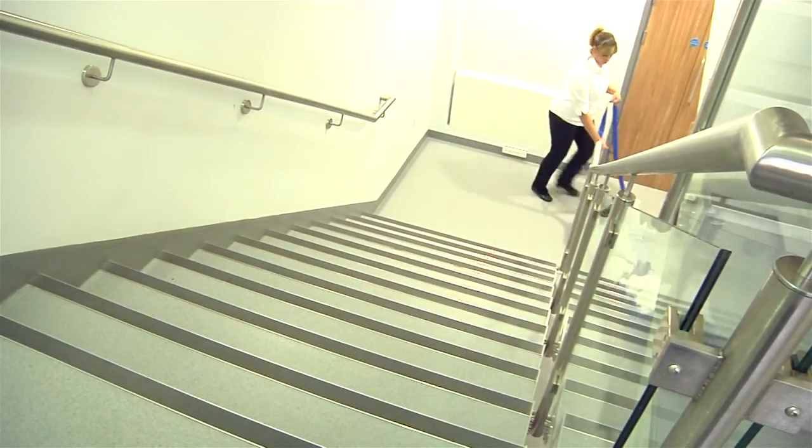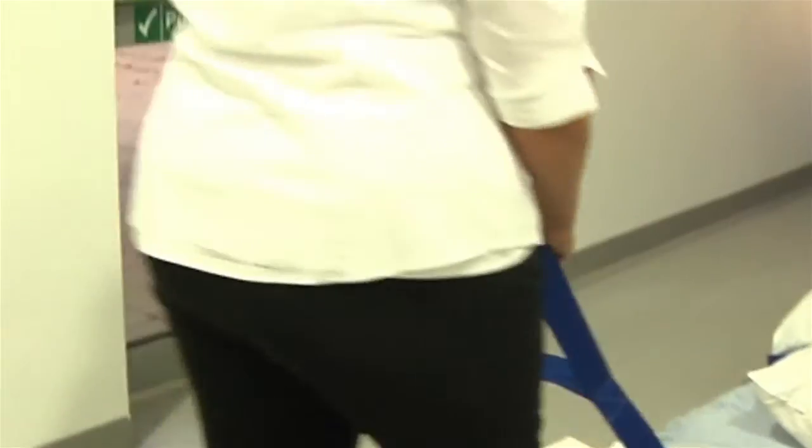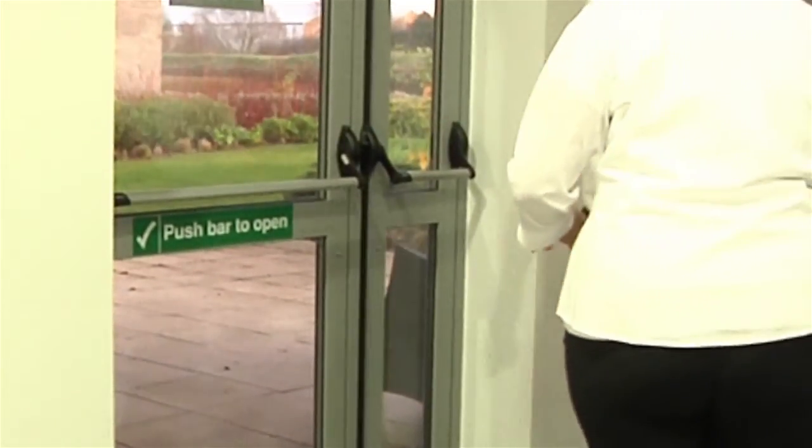Once the patient has exited the building and reached a point of safety, the cross straps can be loosened to ensure the patient is comfortable.